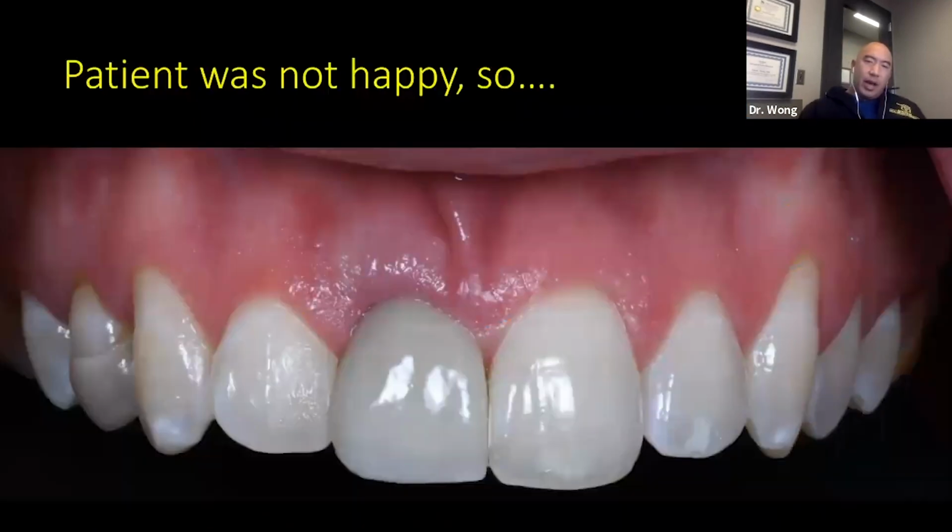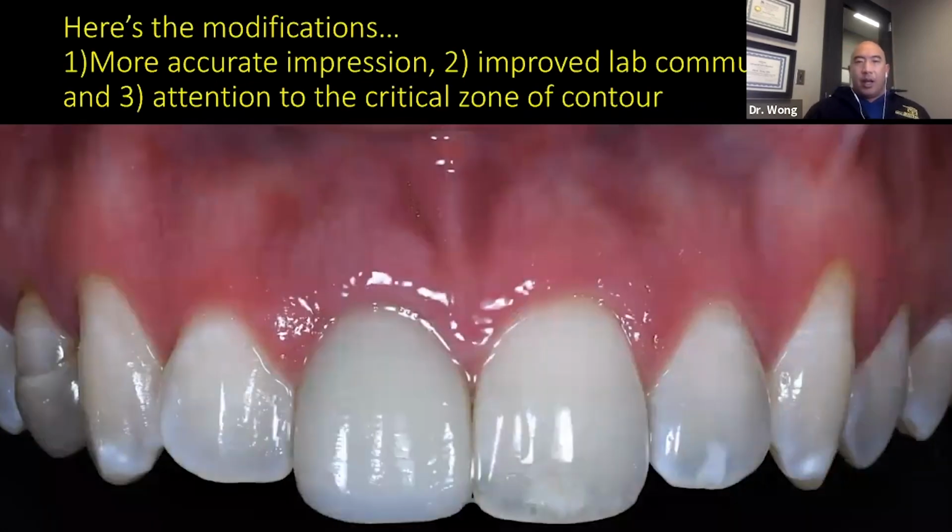So what we did after the modification is, instead of using that as the final restoration, we use that as the provisional restoration. So we make the custom impression copings, make a more accurate impression, and communicate with the lab a little bit better. And we pay attention to that critical zone of contour, which is something that you may have to educate your lab about because they may not know that, right? Because natural teeth don't have that critical zone of contour like implants do, okay? So this is our new final restoration for now.